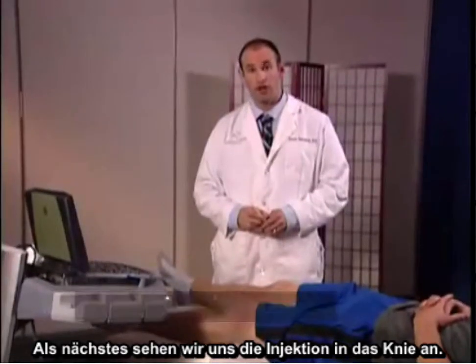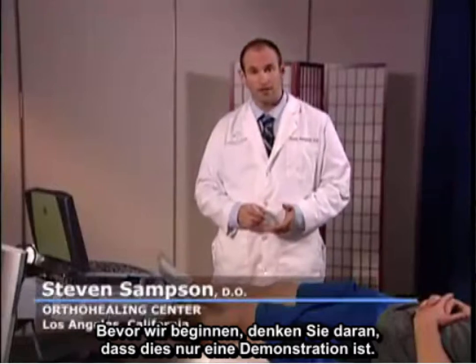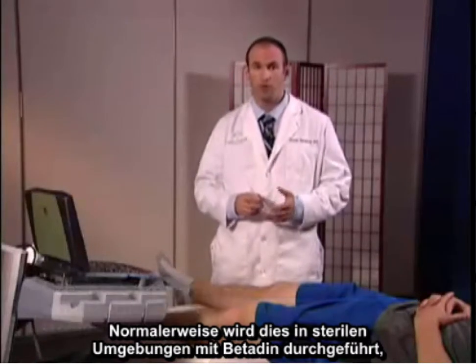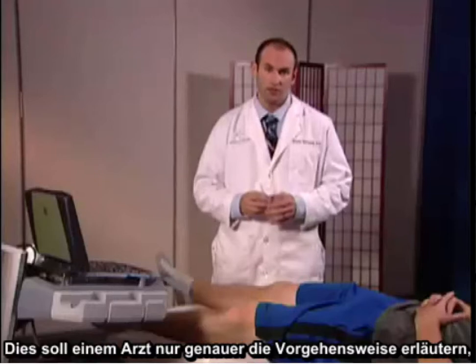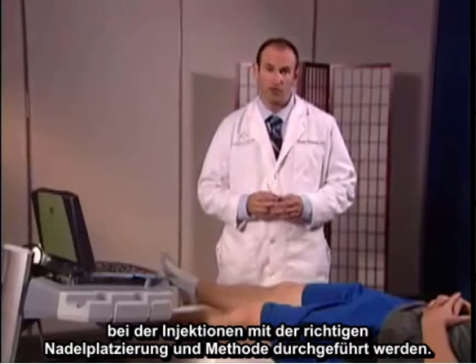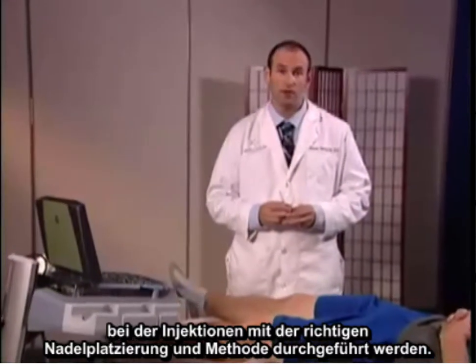Next, we're going to review injection of the knee. Before we get started, keep in mind that this is just a demonstration. Normally these are performed under sterile environments with betadine and proper prepping of the area. This is just meant to show the physician exactly the approach that we use in doing injections with the proper needle placement and approach.